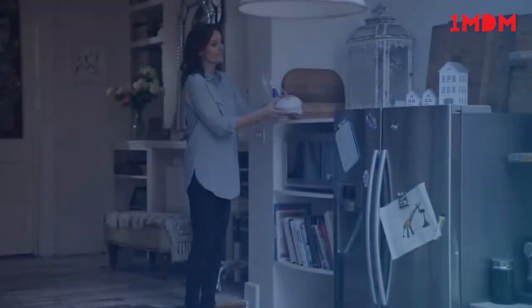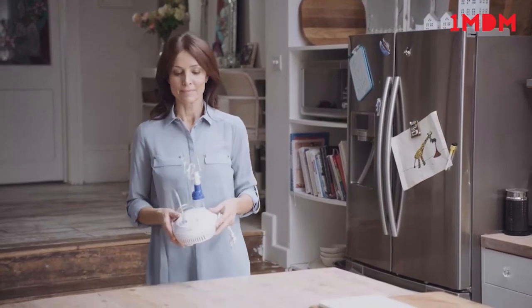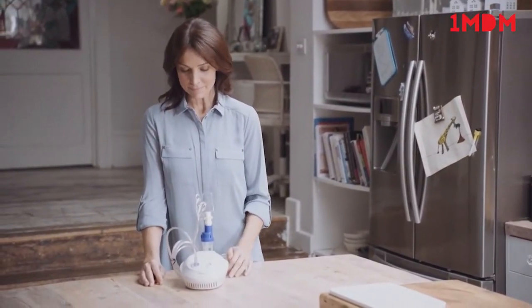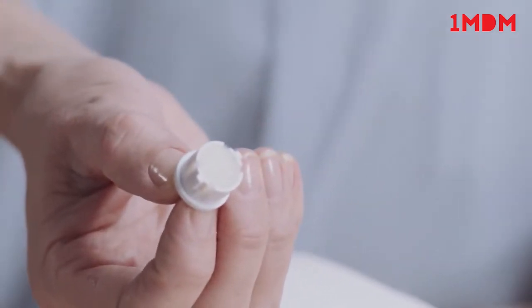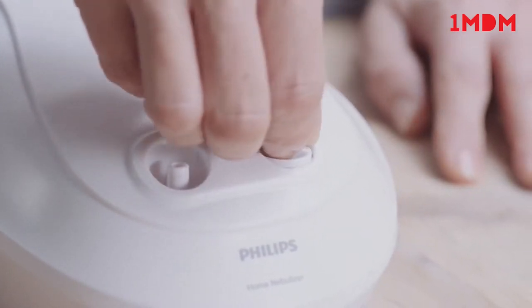Place the Philips Home Nebuliser on a firm flat surface near an electrical outlet in an area where the user can be seated comfortably during their treatment. Check that the filter is not clogged, dirty or wet and replace if necessary. Operating the unit with a dirty filter can impair proper operation and cause damage that's not covered by the warranty.